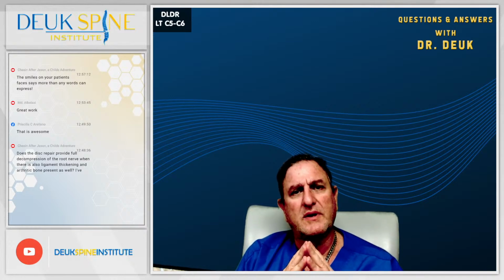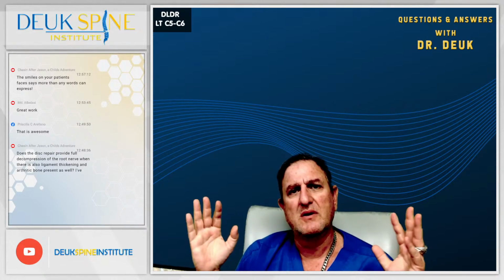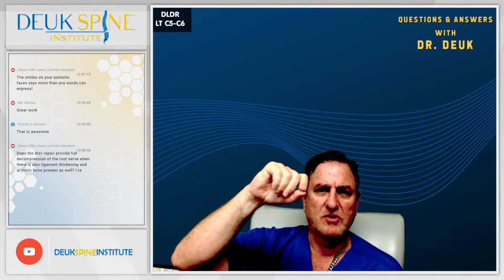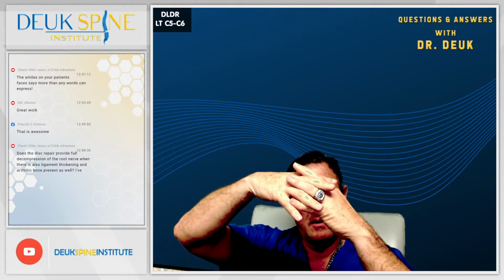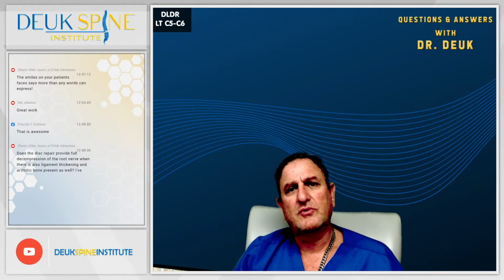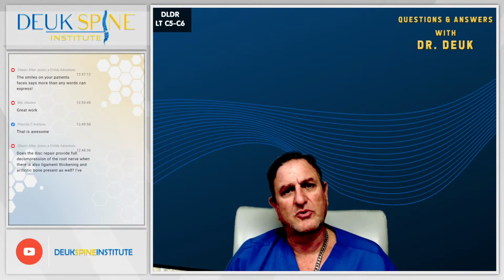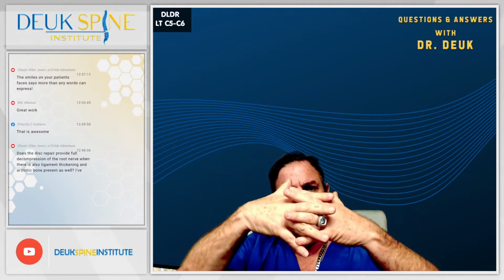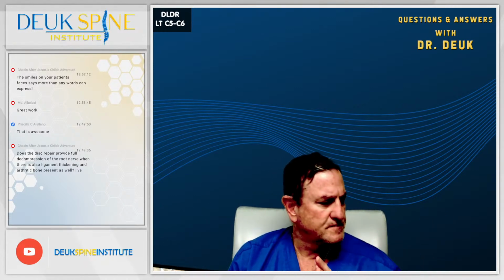Yeah, so ECAF, the laser surgery you just watched will literally stop the disease from progressing. Once we clean the tear with the laser like we just did, the tear will mend and seal. It cannot do that until we take the herniation out. And the Deuk laser disc repair is the only surgery in the world, right here at Deuk Spine, that cleans out the tear and lets the tear heal. Once it heals, the disc will not degenerate anymore.